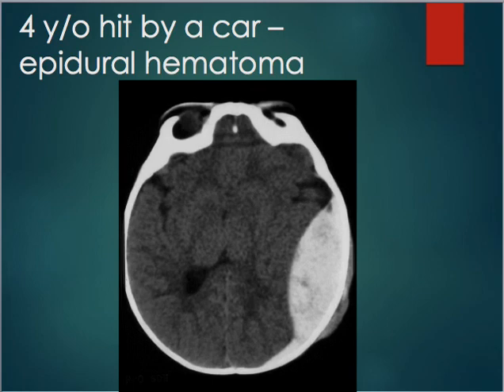This is a 4-year-old that was hit by a car. They have an epidural hematoma. Remember? It looks like that lens shape.